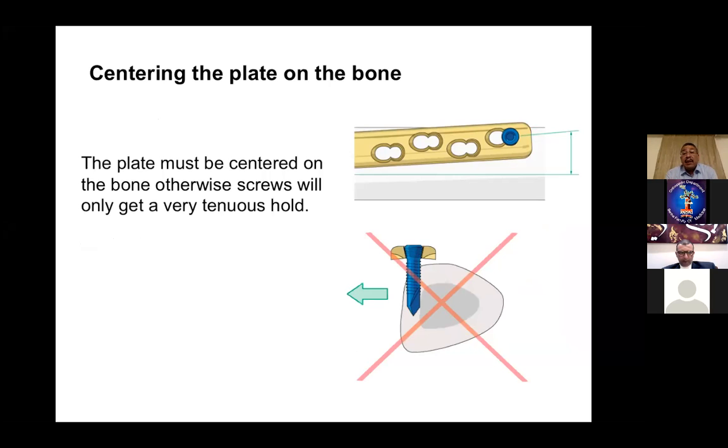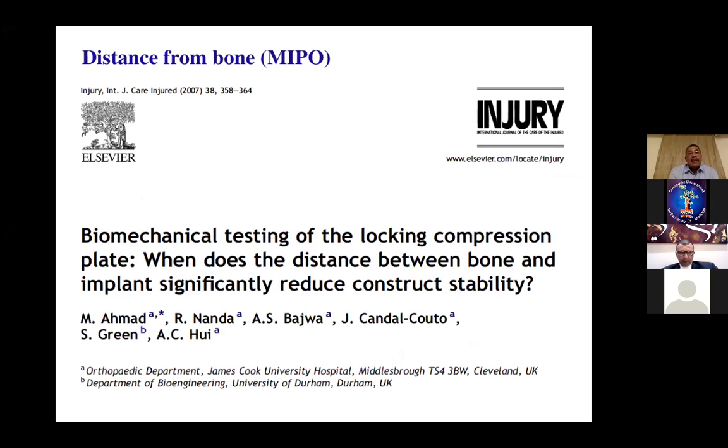And in locked plates, you cannot redirect your screw to have the whole diameter of the bone. This is another important point. So we said in minimally invasive plating techniques, have a small window large enough to allow you to center the plate on the bone, to avoid eccentric positioning of the screws and less working length of the screw.